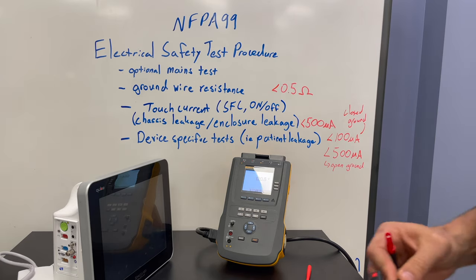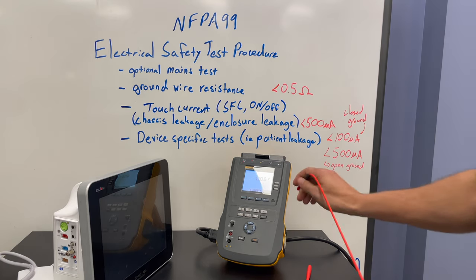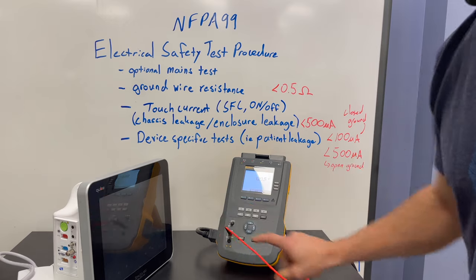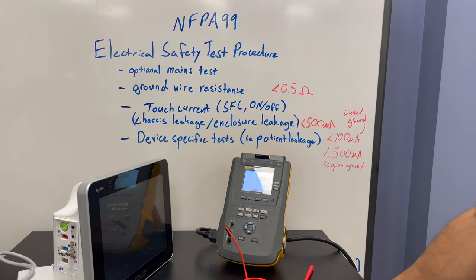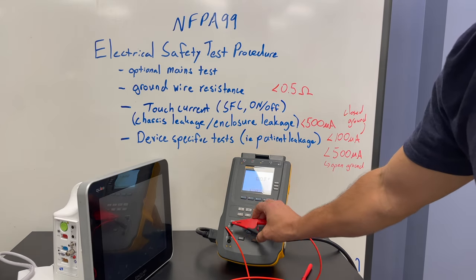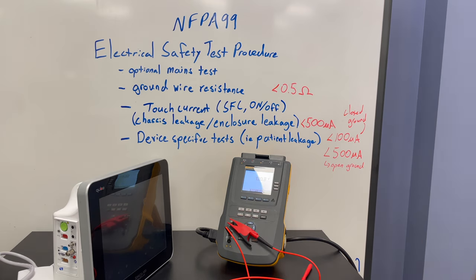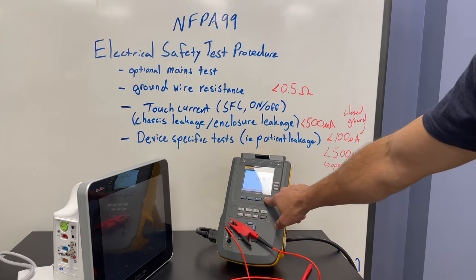The first thing we're going to do is the ground wire resistance test — always the first step, assuming you've already done the physical inspection. One of the nice things about the Fluke ESA-612 is it has a test point that you can zero the lead on. Once you hit the ohms button, F4 will zero the lead.